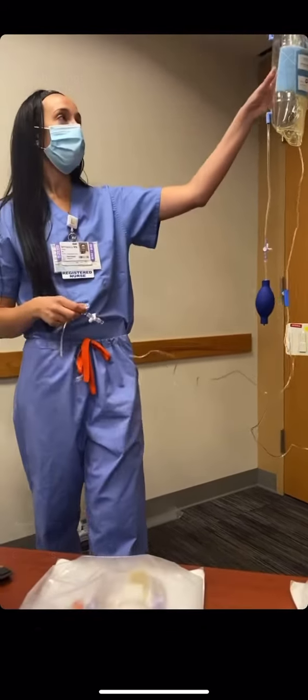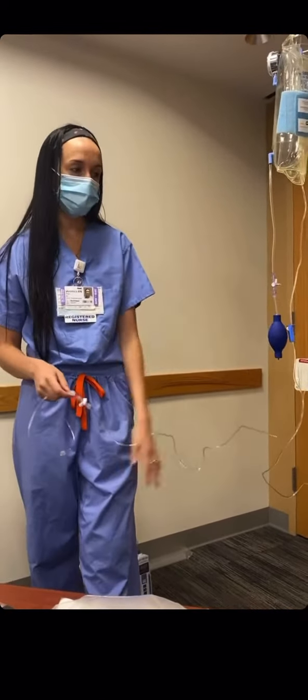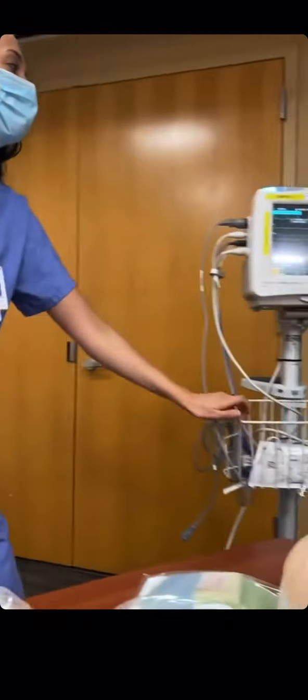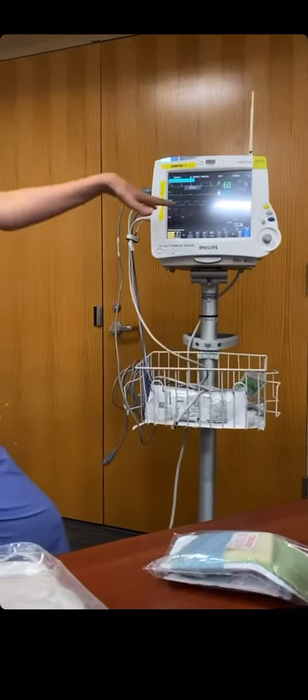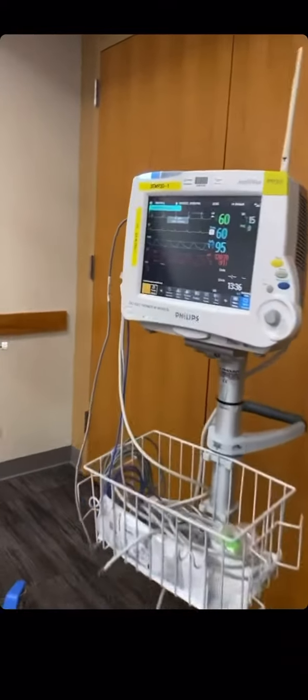Hey guys, so we have our A-line set up already, it's completely flushed through, and we're ready to zero it out on the Philips monitor. Here on the Philips monitor we have our pressure cable that we've already plugged in, and it's going to signal to you that the monitor is ready for a pressure reading.